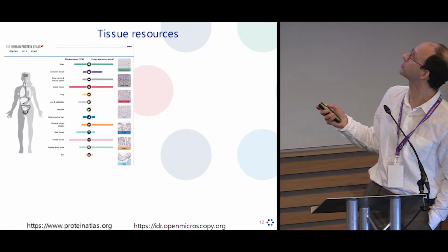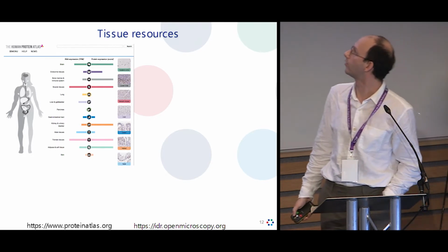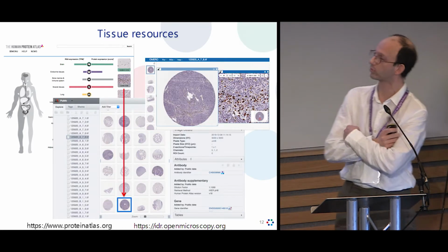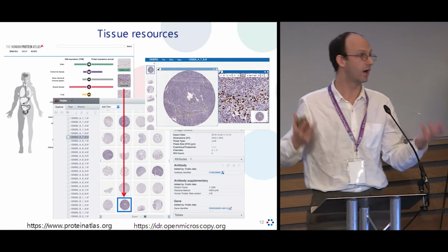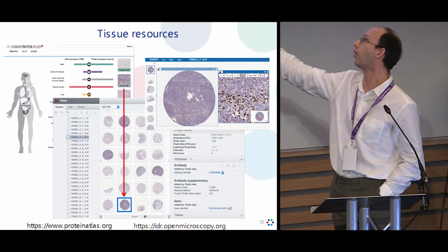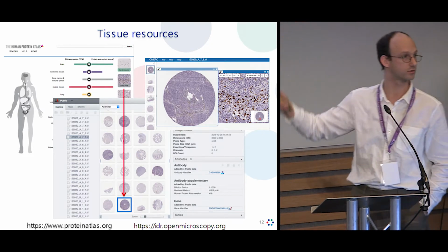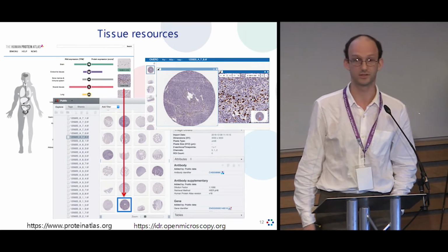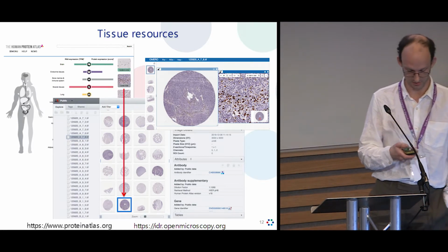So we have started building such a resource in collaboration with EBI, and as an example, we've started joining forces with the Human Protein Atlas project, taking all the tissue data that they have been working on, and which is available via the atlas, and making all the imaging data slowly, terabyte by terabyte, available in a public resource that is accessible today publicly for reusability. And if you want to know more about that, feel free to come and ask some questions.